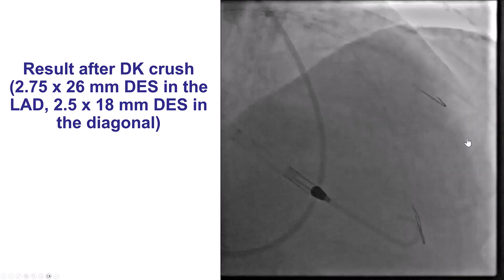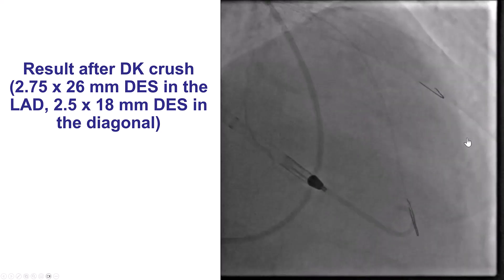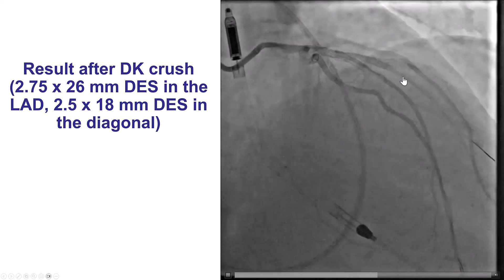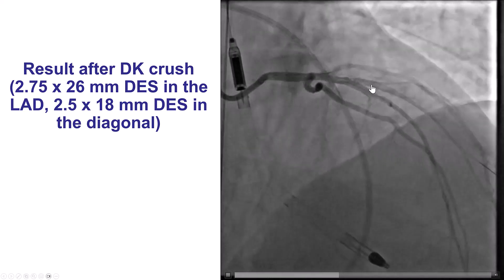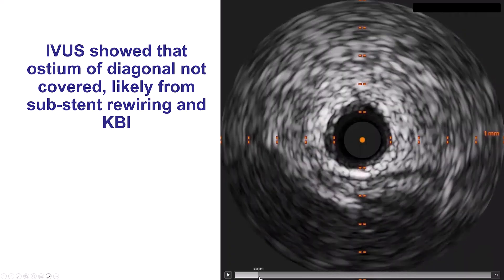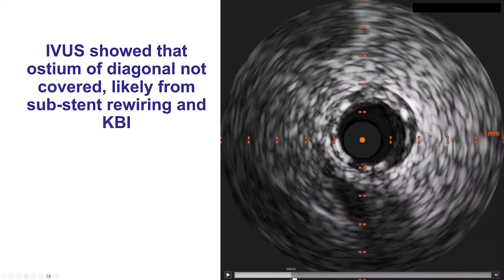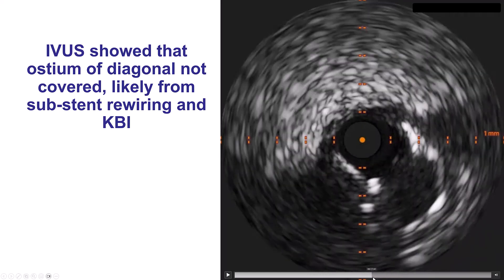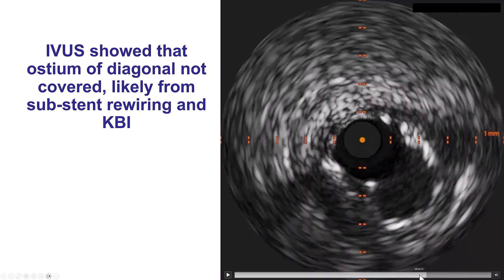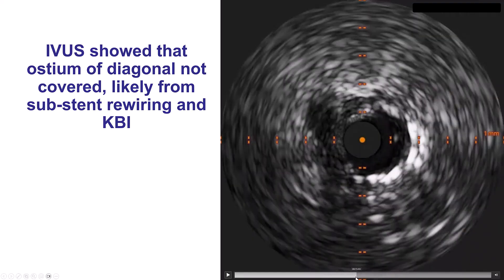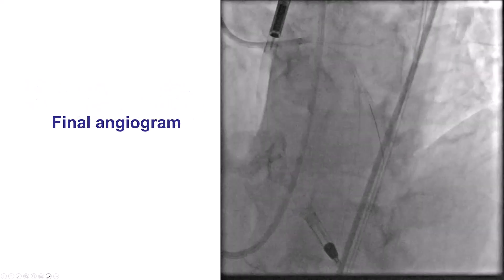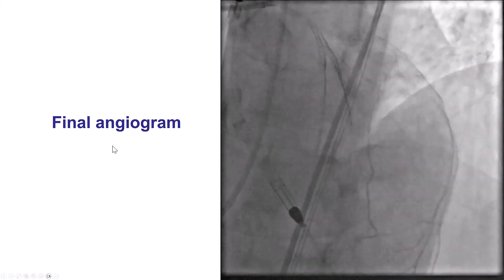Given the challenges we had, we decided to use a two-stent upfront technique for the bifurcation. It was so difficult to wire the diagonal that we did not want to use the provisional approach. So we did a DK crush, and overall it looks okay, but there is an area of concern in the proximal vessel. This is the intravascular ultrasound coming back from the diagonal — about a 2.5 mm vessel. The stent looks okay, but as we get closer to the LAD at the bifurcation, there seems to be an area where we don't have a circumferential amount of stent. So we placed an additional stent into the proximal portion of the diagonal, and that provided a nice result with TIMI flow in both vessels.